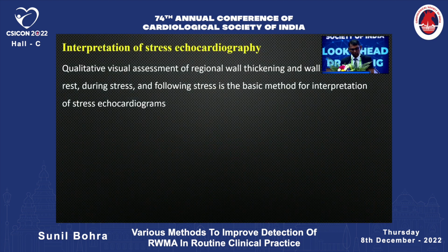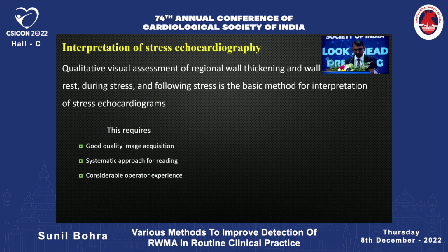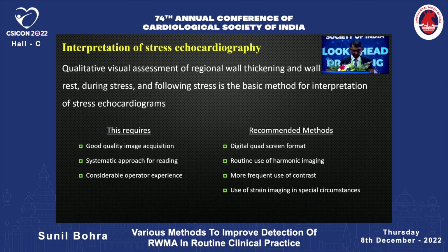Interpretation of stress echo: the qualitative visual assessment of wall motion, thickening and the motion during rest, stress and following stress is the basic method for interpretation. This requires good image quality acquisition, a systematic approach for reading, and considerable operator experience. The recommended method is that we should use the digital quad screen format. Routine use of harmonic imaging is recommended. More frequent use of contrast, and use of strain imaging in special circumstances, is recommended.